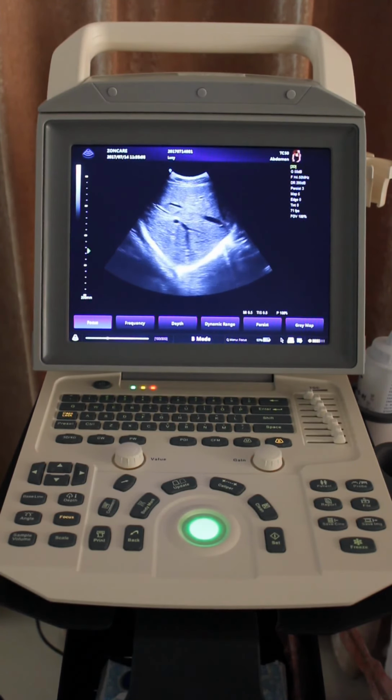Okay, then we come to the final step about the ultrasound report. As we see in the report, here there is a report button. We open it and we can see the first page is about the general parameters, where we have already input the information inside, like the patient information.